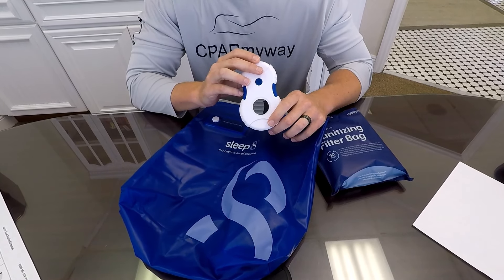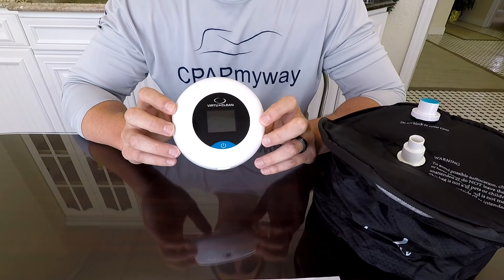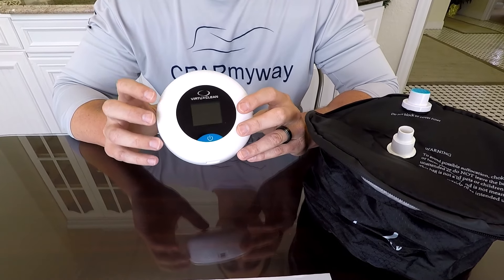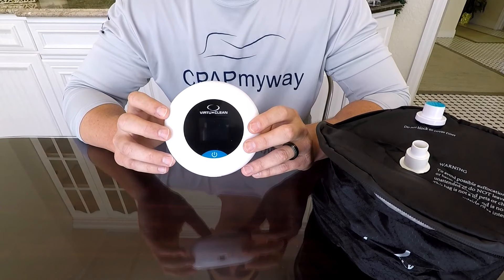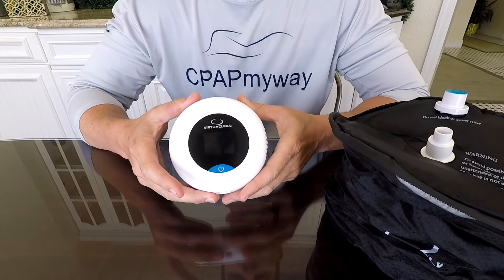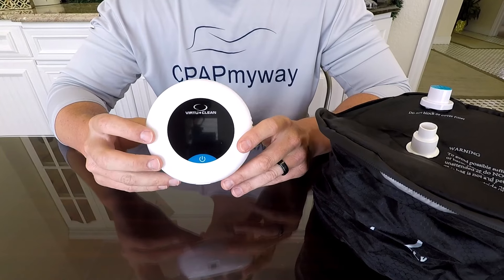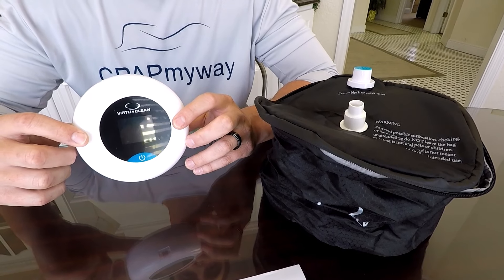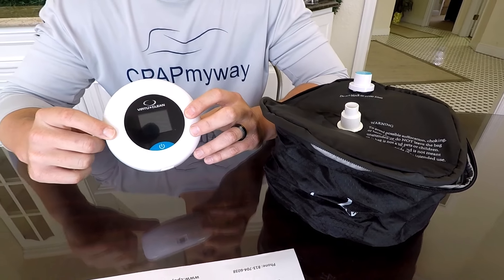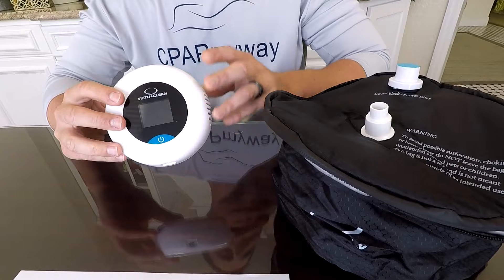Next up is the Virtue Clean 2.0 CPAP cleaner. This is another really nice unit that we've had a lot of positive feedback on. Just like the Sleep 8, it cleans using ozone — ionized oxygen — and it's really simple to use. Overall it's 4.6 inches across and 2.5 inches thick, so it's easy to travel with as well. With a built-in lithium-ion battery and mini USB charging, just like the Sleep 8, it's very travel friendly — you can take it anywhere and use it multiple times before recharging.